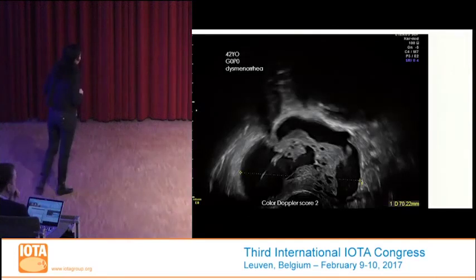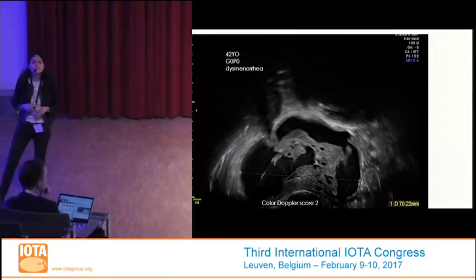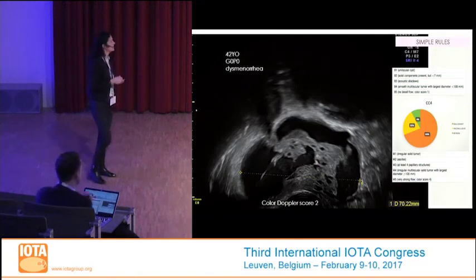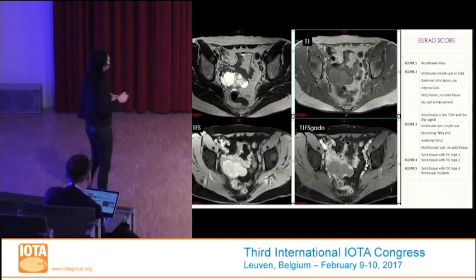Clinical case 4, here, benign or malignant? Benign, malignant. Okay, like during the questionnaire yesterday, most people say it's probably malignant, this lesion. So we will look at the MRI, and when we look at the MRI, you have T2, T1, T1 after fat suppression, and T1 after fat suppression and gadolinium injection.